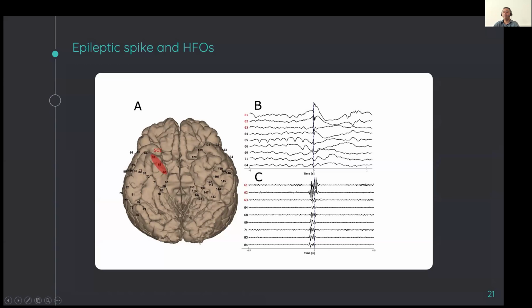This is another type of spike that comes in a bunch of spikes that happen next to each other. Even though we see some rates are low here, the locations are focal to the epicenter. But for the spike, we can see it is spread across the whole brain.